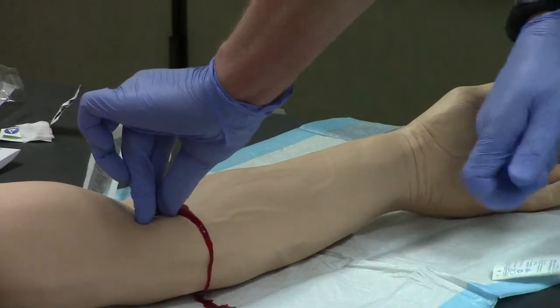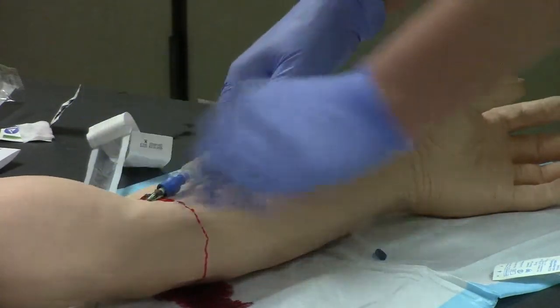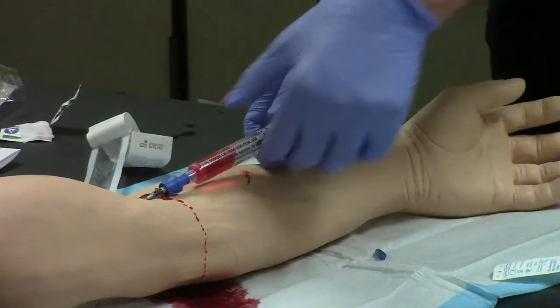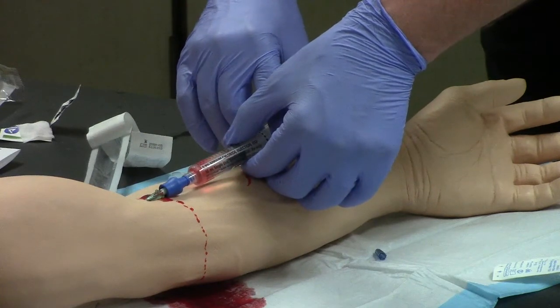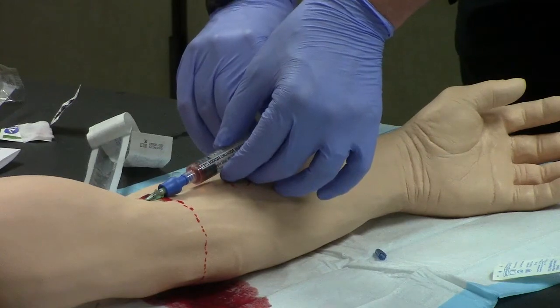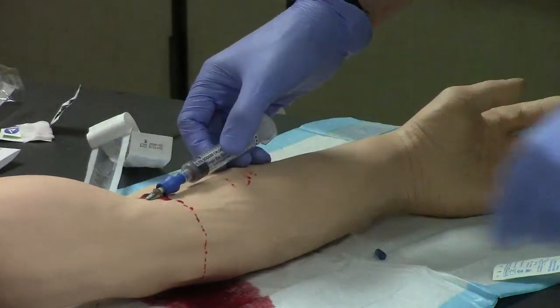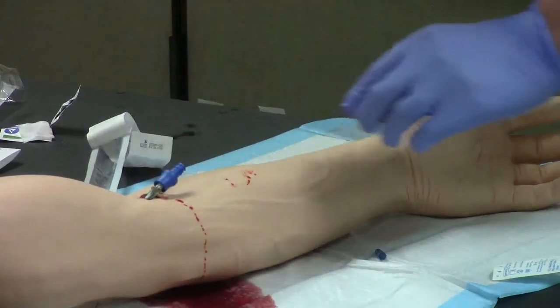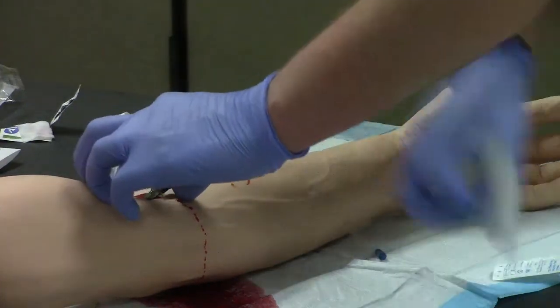The needle goes into an appropriate sharps container, and then we're going to attach our lock — pull back, we have a return of blood, so we have a good line. Flush the line with my saline. At this time I usually tell my patients that they may get an odd or weird taste in their mouth — a lot of patients will be able to taste the salt. We're going to pull off the flush, leaving the lock in place.